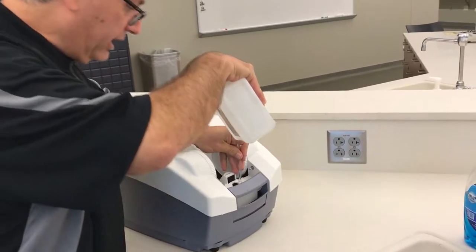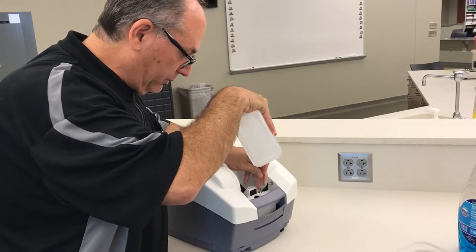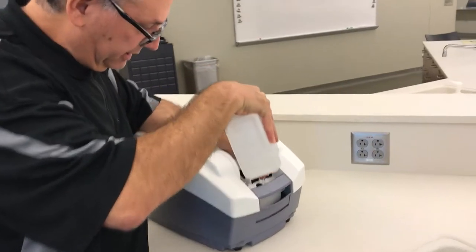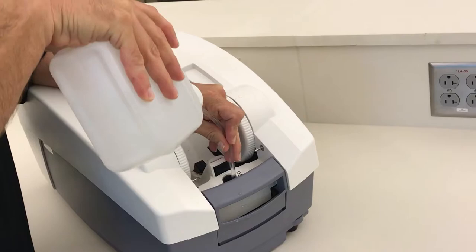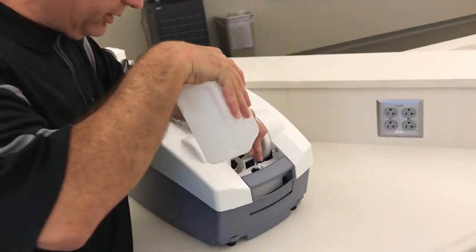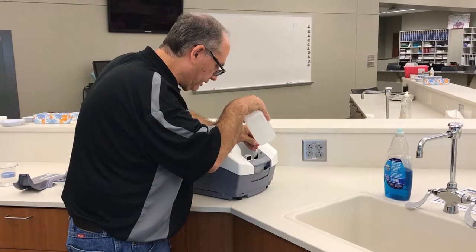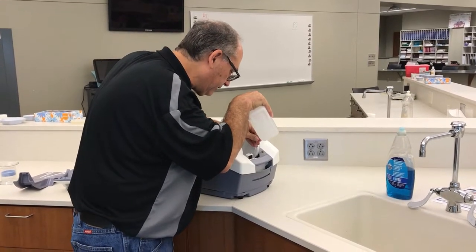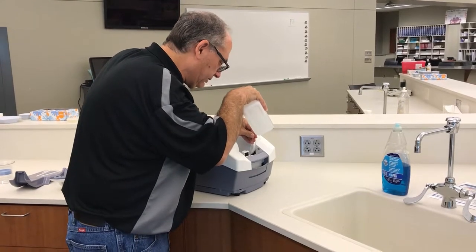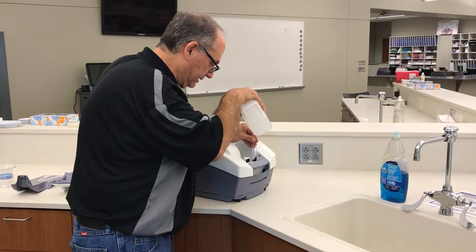Let the water go in and watch until it visibly comes up to the base of the threads. It takes a fair amount — usually at least a gallon of distilled water. If a little water spills out on this part it's okay; you don't want to soak the machine, but getting it a little wet is fine. Just try to minimize any spills.